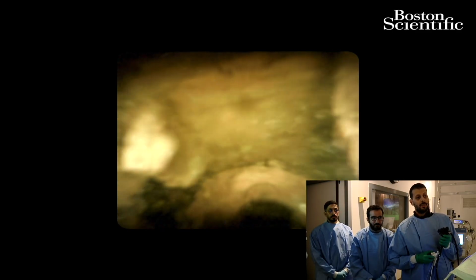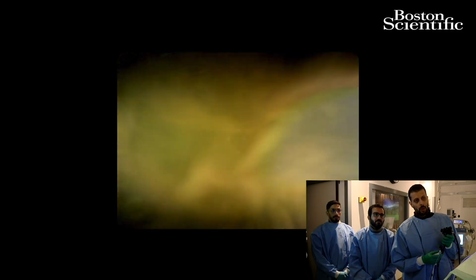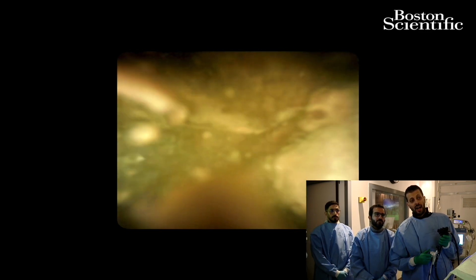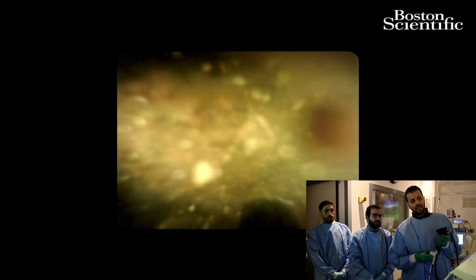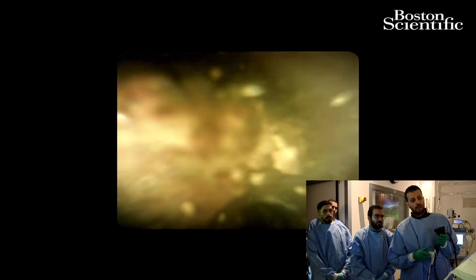These systems that we have here for both the EHL and laser are pre-set into low, medium, and high. Sometimes, if you want the catheter to stay longer, we put it on low so that it gives us a longer half-life of the catheter. And we put it on high if we have a single hard stone, such as in the pancreatic duct. But for patients who have multiple CBD stones, on laser and EHL, we try to go medium or low so that the catheter gives us the longest half-life.